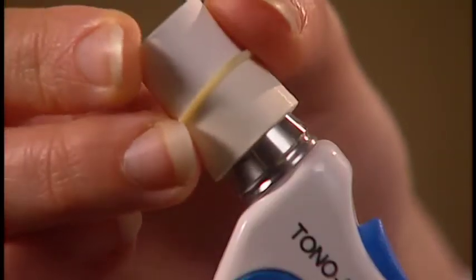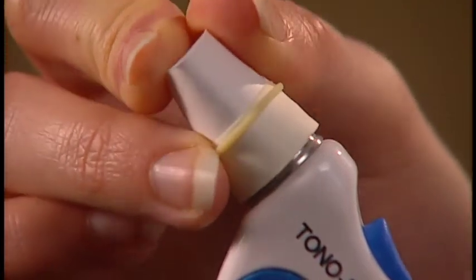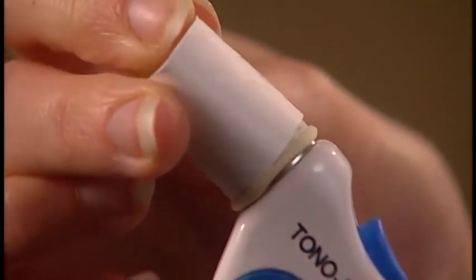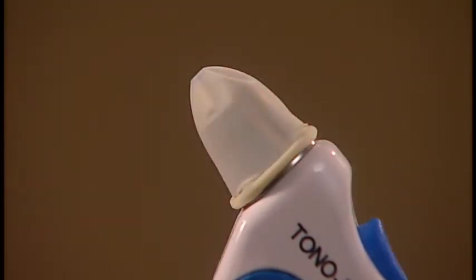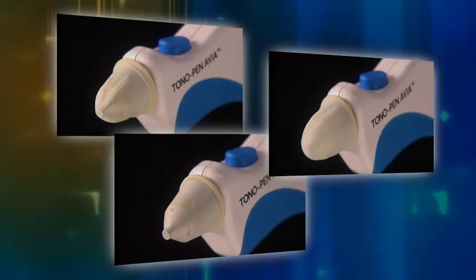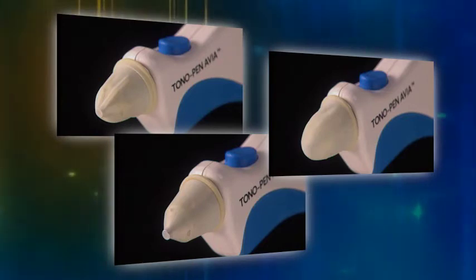Occufilm tip covers are very easy to use. They are simply rolled on using the integrated cardboard applicator like this. However, care must be taken to ensure that the Occufilm tip cover is not applied too tightly or too loosely over the transducer.